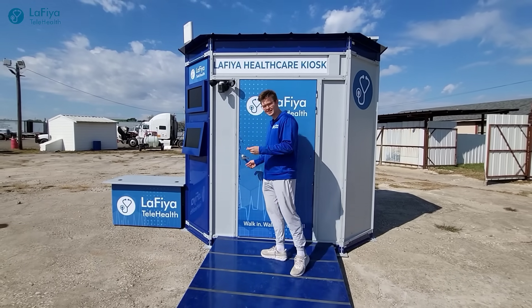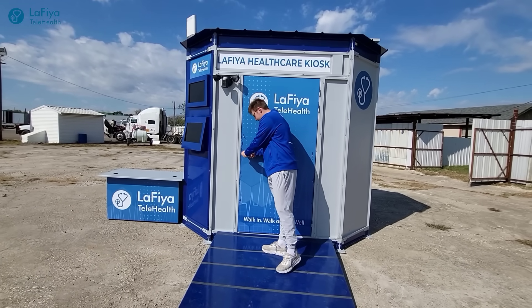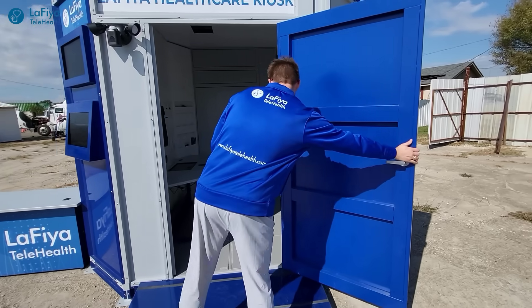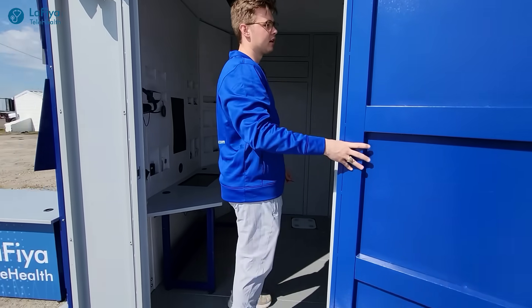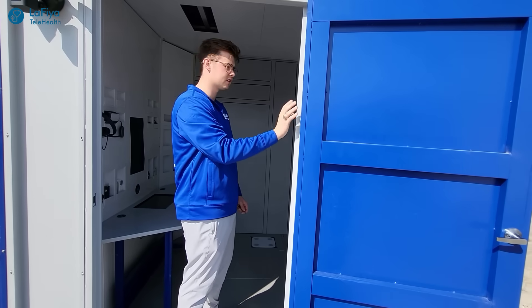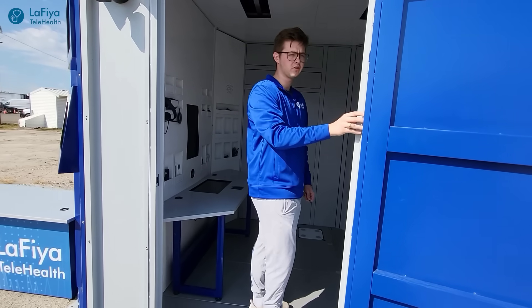Now we're going to take a look inside the kiosk and what it has to offer. We open this door up — keep in mind this outdoor kiosk is built with steel. All of this is going to be very sturdy and durable for all weather conditions.